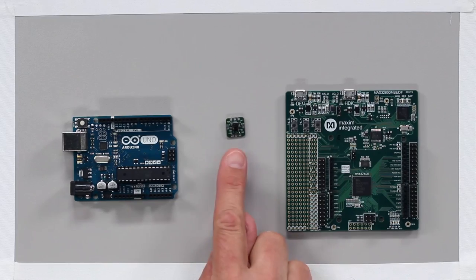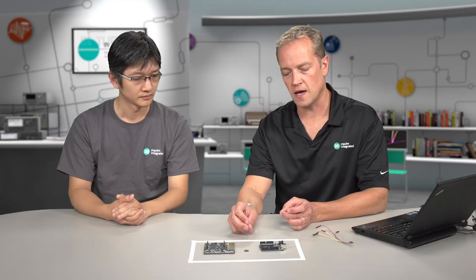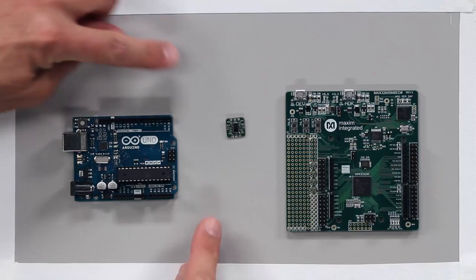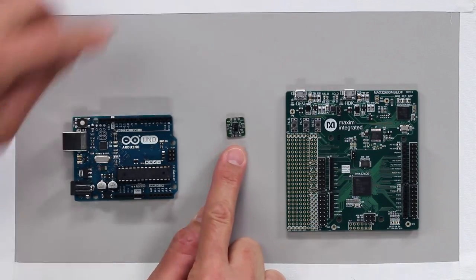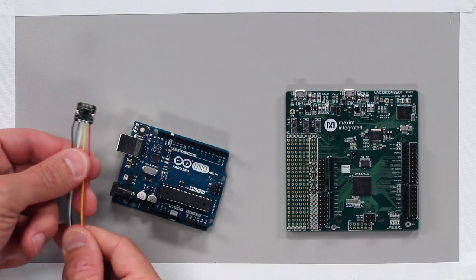So what we wanted to do today is go ahead and get this guy going and show you how it operates. So I'm going to go ahead and pull it together. You can see, if you look at the board itself, what we've done is we've made a small board with thicker pads there so that you can stitch it into any kind of wearable piece of garment or apparel that you want to wire it into. And we've also mirrored the I2C lines on both the top and the bottom of the board. So I'm just going to point in here and you can see the top and the bottom. That's got your SCL, your SDA, and your interrupt lines, and the bias voltage and the ground are on either side. So I'm just going to go ahead and show this other module where we've already soldered in some wires just to make the setup a little bit easier.